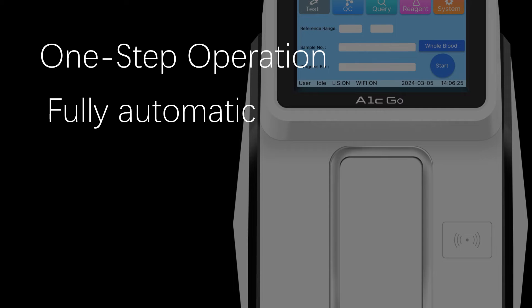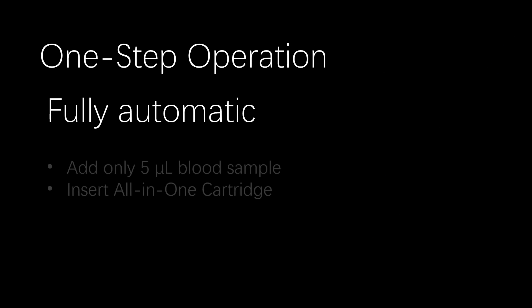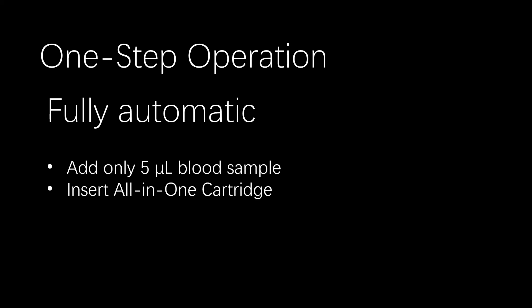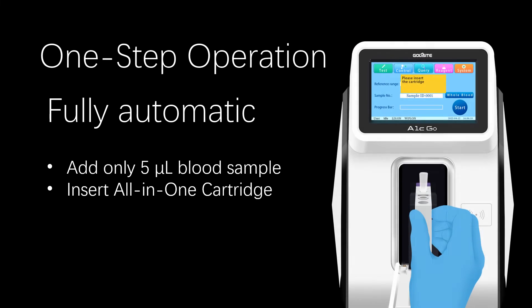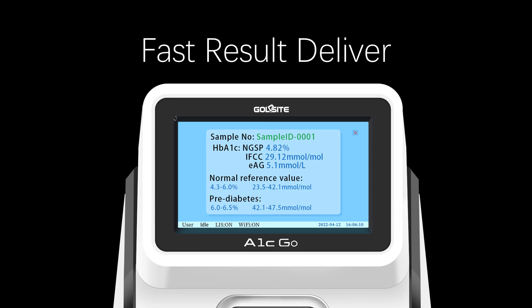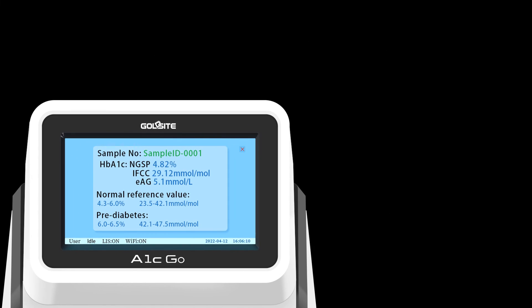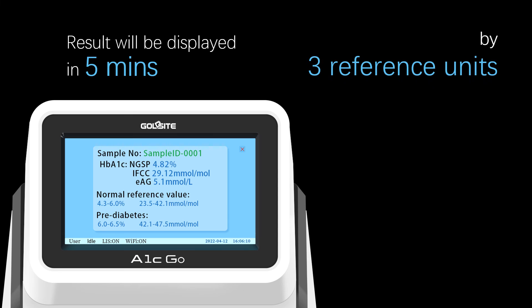Fully automatic one-step operation. First, add only 5 µL of blood sample. Second, insert the all-in-one cartridge. Then click to start the test. Results will be displayed in 5 minutes in three reference units: NGSP unit, IFCC unit, and eAG unit.